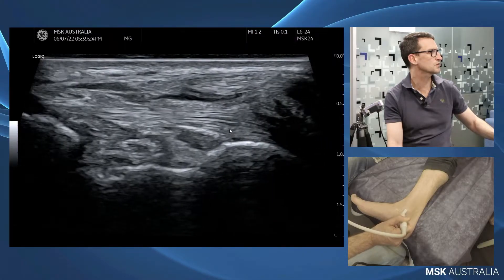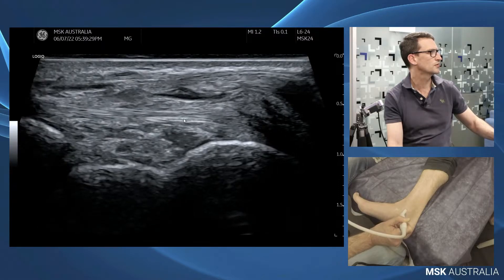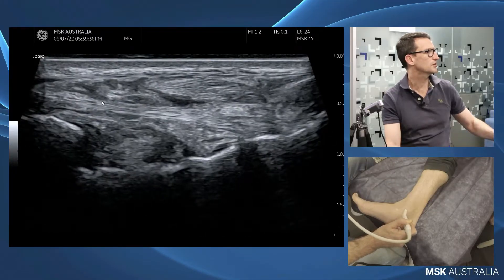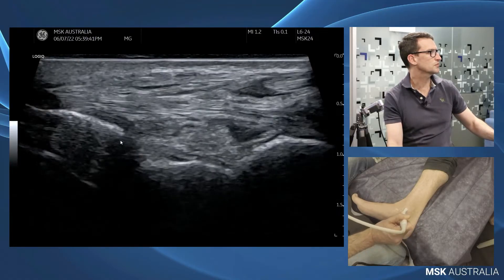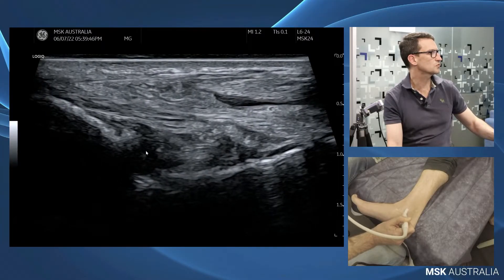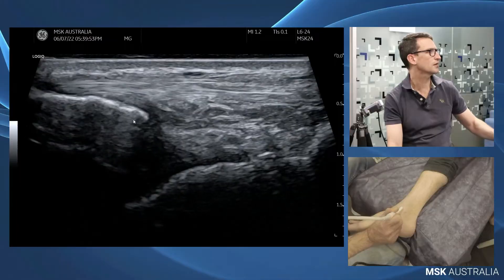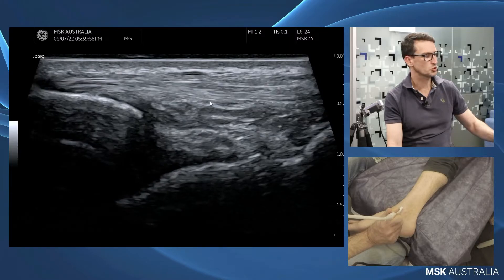If we follow that down we can see it merging in with our spring ligament here — so this is our tibio-spring. Rolling back a little we get onto the sustentaculum tali and here is our tibio-calcaneal. Deep to those we can see a little component of our anterior deep deltoid, and if we plantar flex and roll a little forward we can actually see our tibio-navicular component, which is this thin band that can sometimes be present.